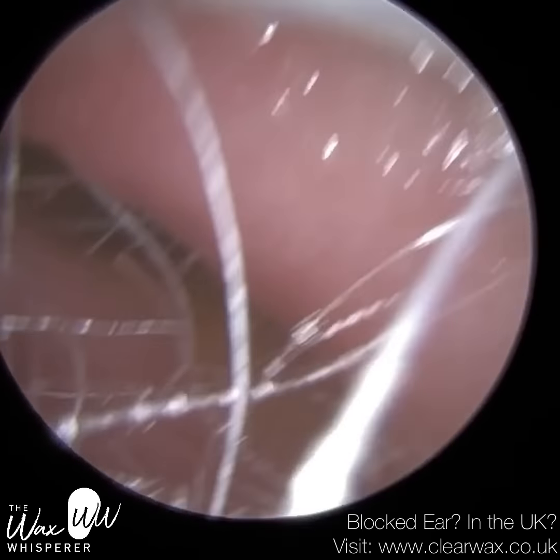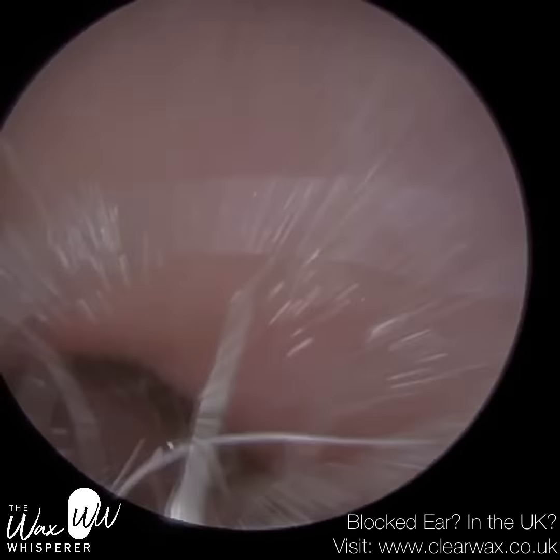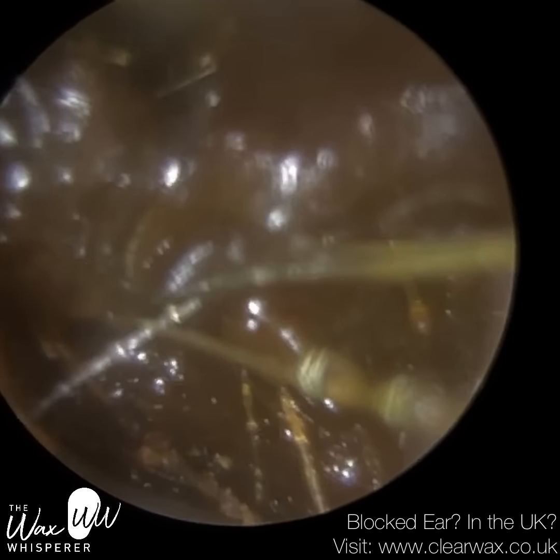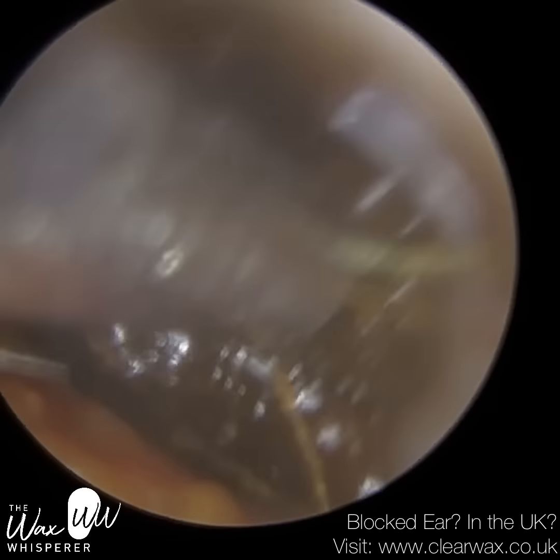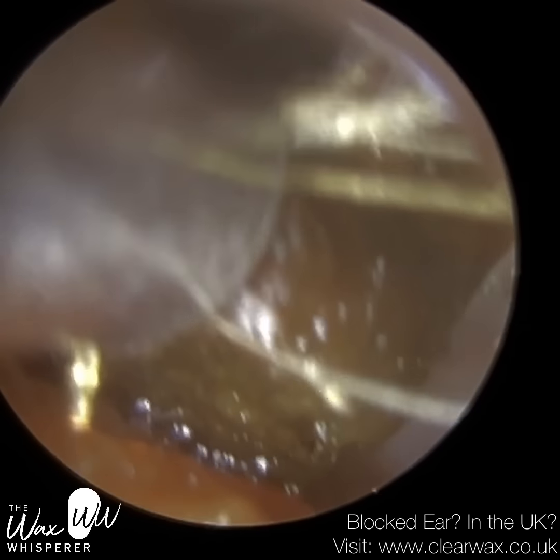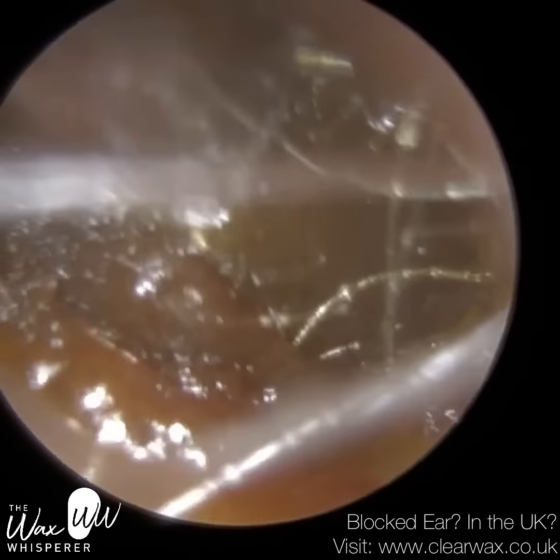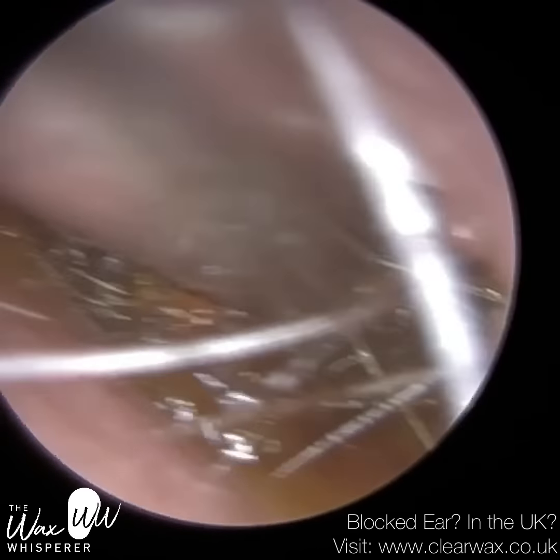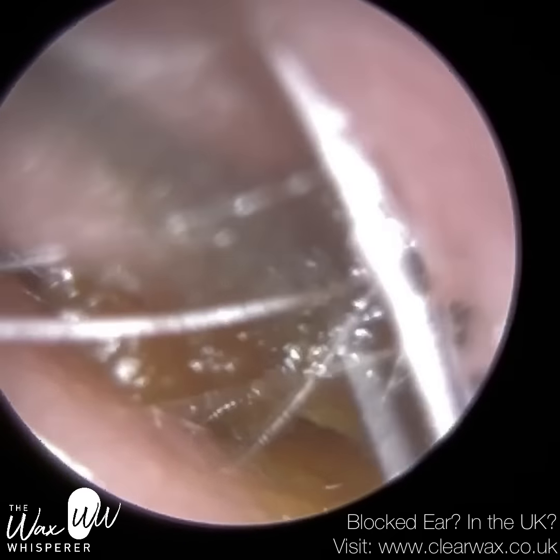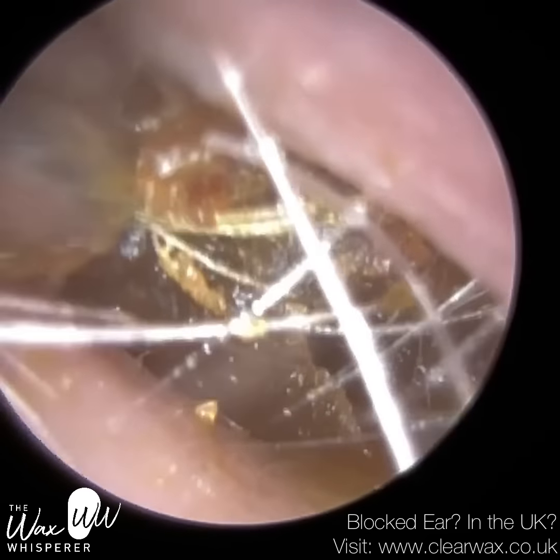I'm actually performing microsuction whilst the olive oil is in the ear. When I first started using olive oil ear spray during procedures, I used to ask the patient to tilt their head so the oil could seep in and soften the wax, let it soak for a few minutes, then tilt the head the other way to drain the drops before going back in with the sucker. But now more and more I just perform suction whilst the olive oil spray is in the ear — I find it's more effective, though it can be more challenging because the suction probe is vacuuming both the wax and some of the oil, which can cause some blurring at the tip of the endoscope. You just come out a few times and wipe the tip with an AlcoWipe.